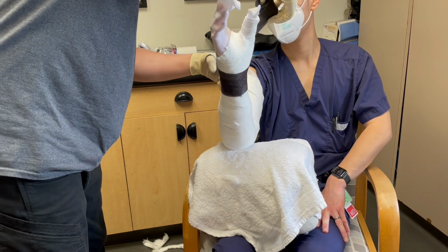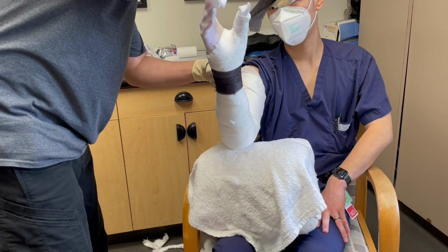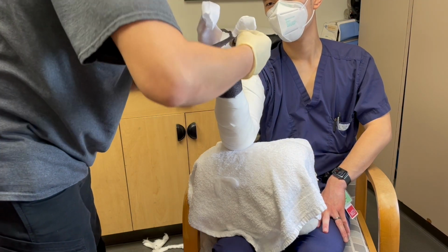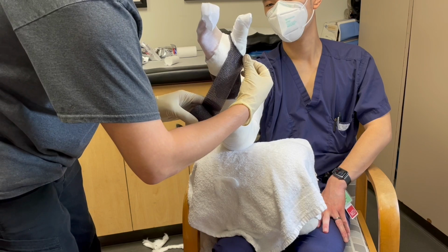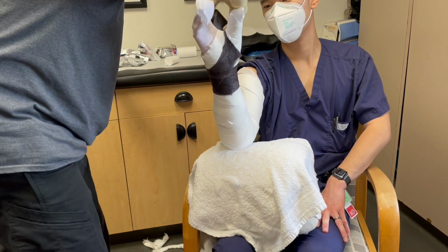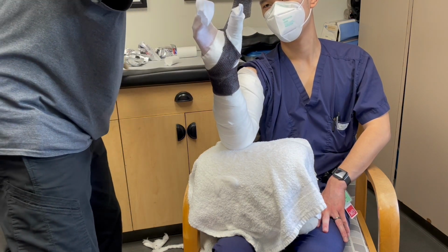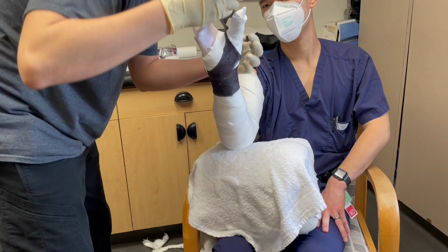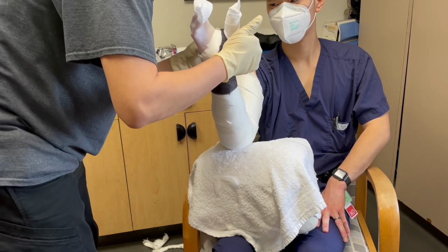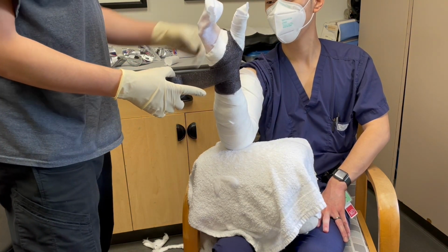We make an L-shaped cut in the fiberglass to lay the splint across the web space. We do another L-shaped cut, again to lay over the web space. This would essentially complete the distal end of the short arm cast.